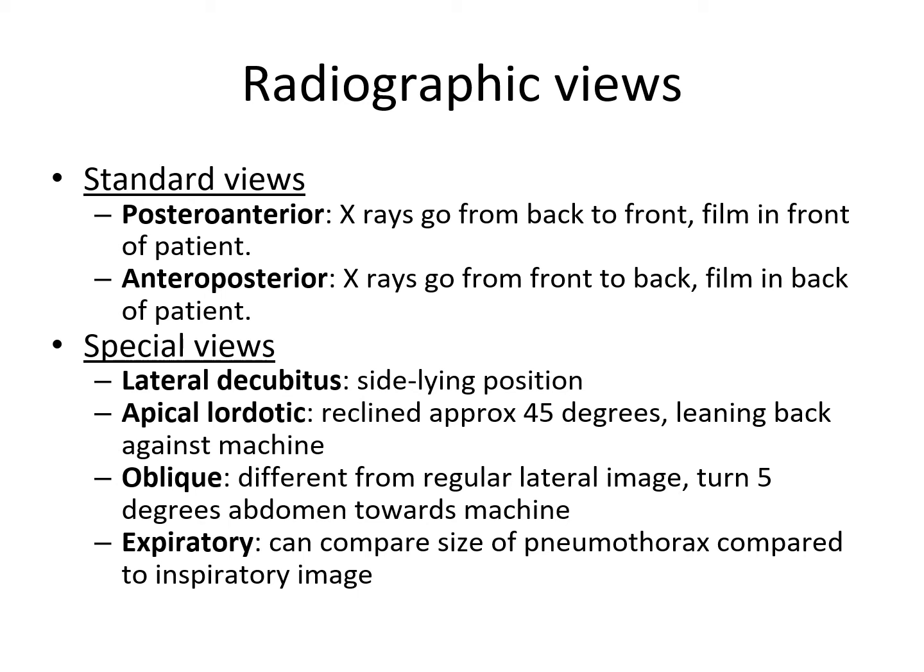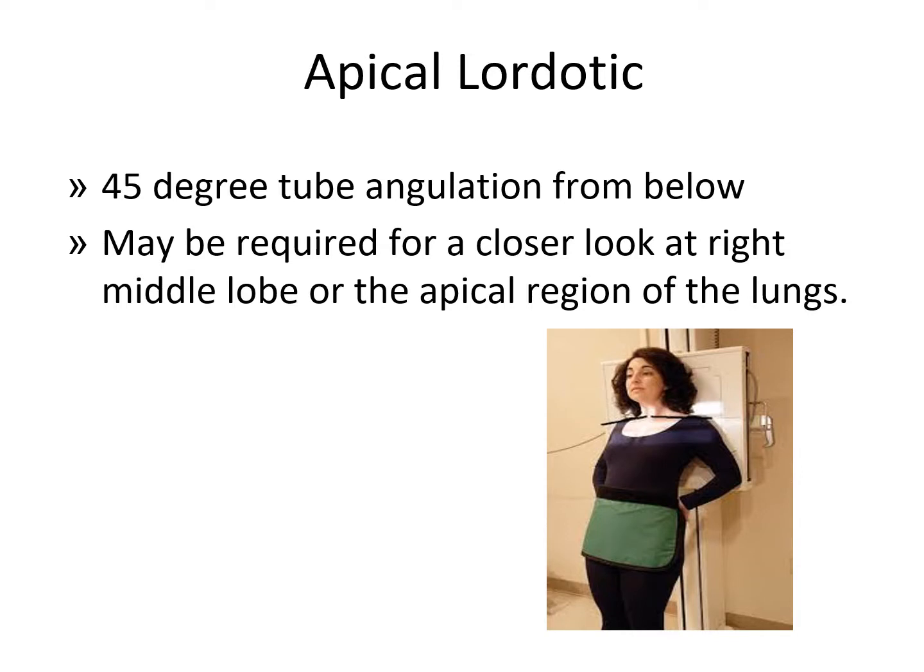That is a question that advanced patient assessment got wrong on one of their MRE assignments. So you want an expiratory view to help you diagnose a pneumothorax. Remember that for third semester.